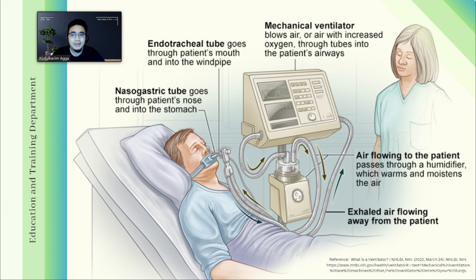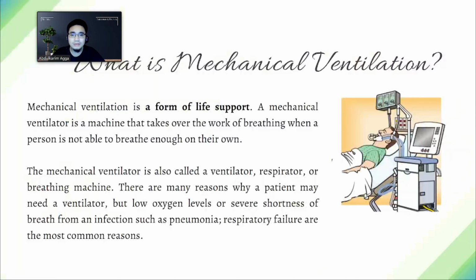So, what is mechanical ventilation all about? You can see in the picture being presented on your screen a sample patient with an endotracheal tube hooked to a mechanical ventilator. We all know that a mechanical ventilator is an advanced airway equipment or airway system that supports the patient's respiration. But let us try now to define what mechanical ventilation is really all about.